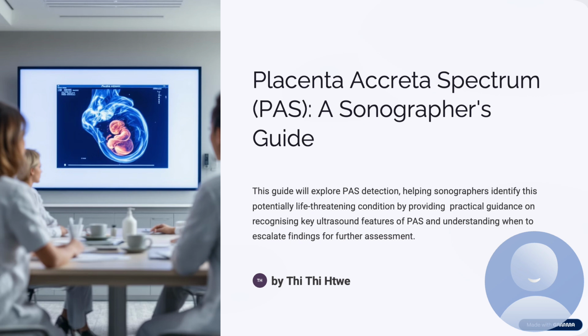So we'll be looking through the risk factors of PAS, epidemiology, and most importantly, ultrasound features that we need to recognize. I'll also touch on how PAS intersects with conditions like placenta previa and the impact of rising cesarean section rates. By the end of this section, I hope we'll feel more confident in identifying suspicious features of PAS on scan, knowing when to escalate and refer, and understanding just how critical your role is in the diagnostics and management of this high-risk pregnancy.